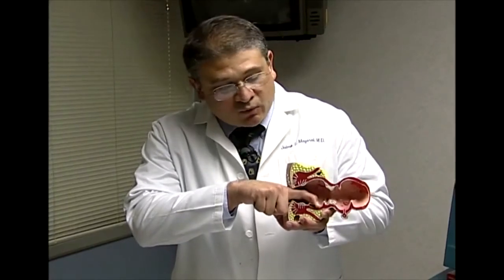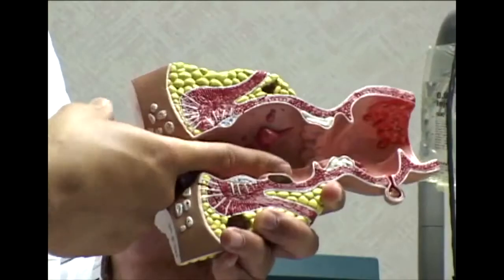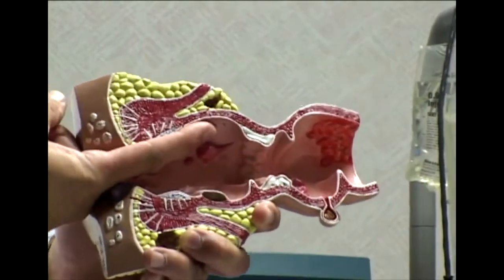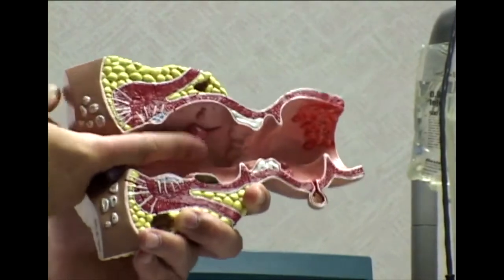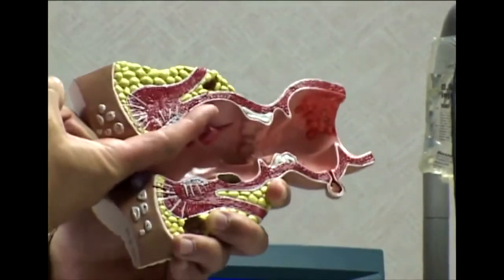Once you identify it on one side, either the right or the left, whichever protocol you'd like to use, you switch back to the coccyx, identify that landmark, and then go again posteriorly and off to the side 90 degrees, and again hooking your finger so as to identify the pudendal nerve.